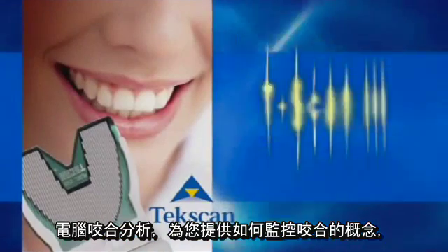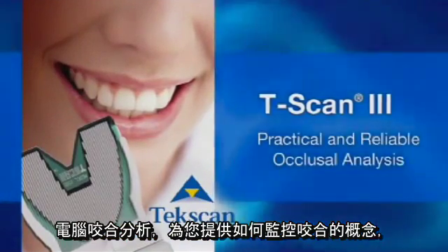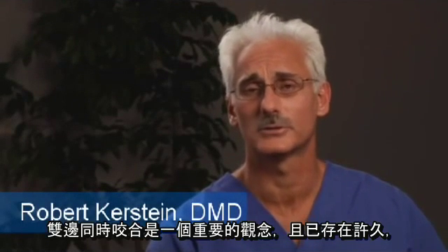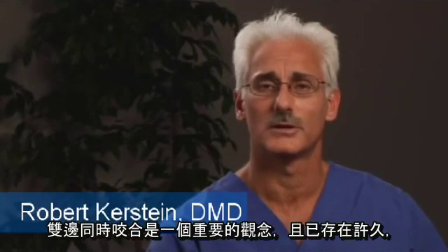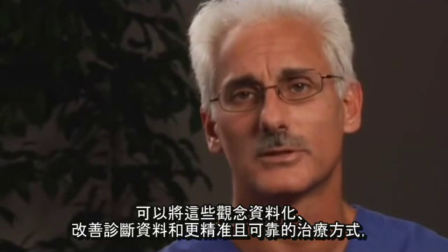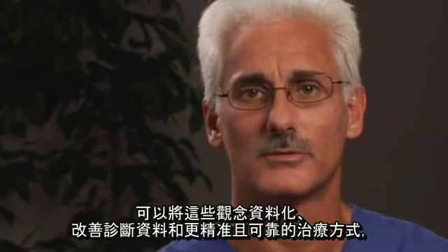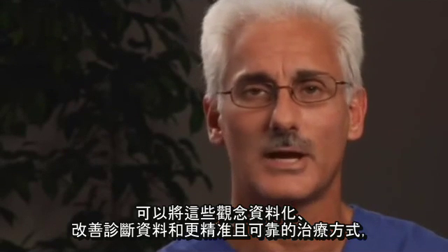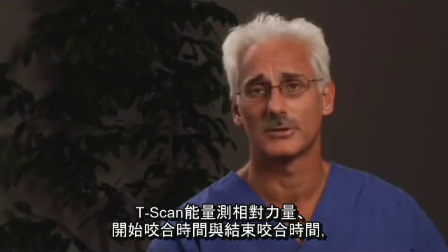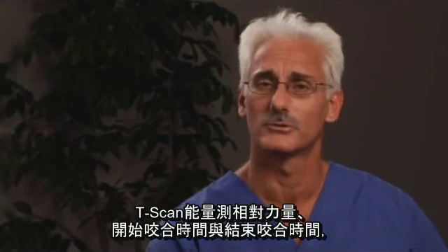Computerized occlusal analysis gives you the control to refine occlusion. The concepts of bilateral simultaneity and immediate posterior disclusion are important and have been around for a long time. With the T-scan, you have an instrument that can measure these concepts for improved diagnostic data and more accurate and reliable occlusal treatment. The T-scan measures relative occlusal force and both the occlusion time and the disclusion time.